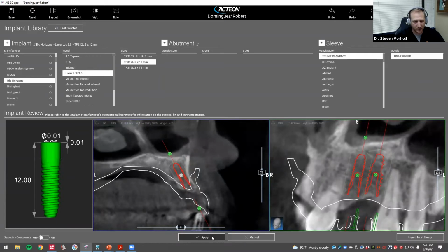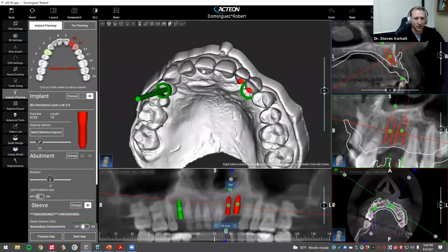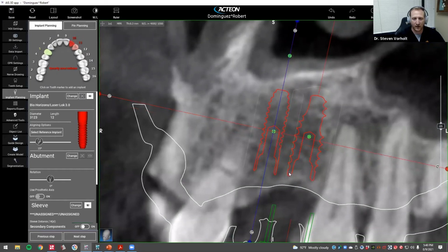And this is the constant problem we have with anterior teeth in the premaxilla. We cannot fit two ideally sized implants next to each other without them being too close. And what is bound to happen is if we were to place these two implants, the bone between the two would die off. We'd have some horizontal bone loss, which would then take the gum. You'd have a big black triangle. You'd have super long teeth. It'd be horrible. So we don't want to do that.